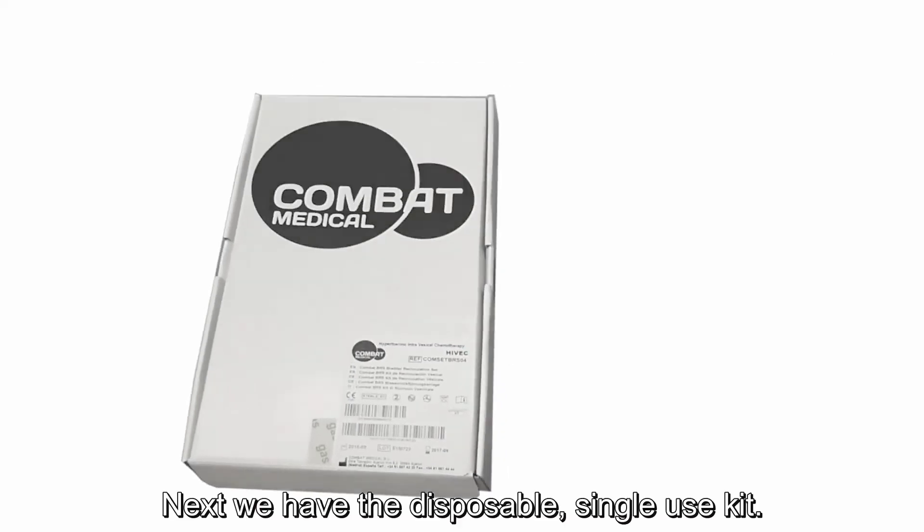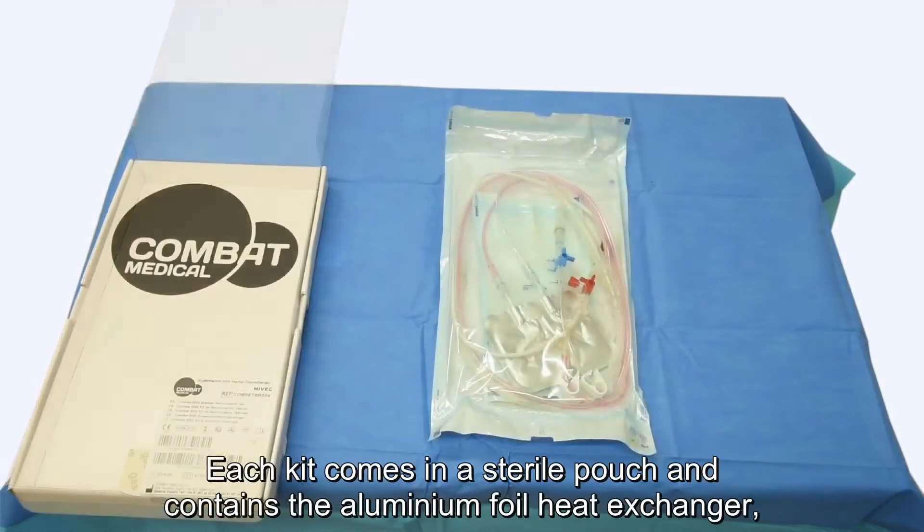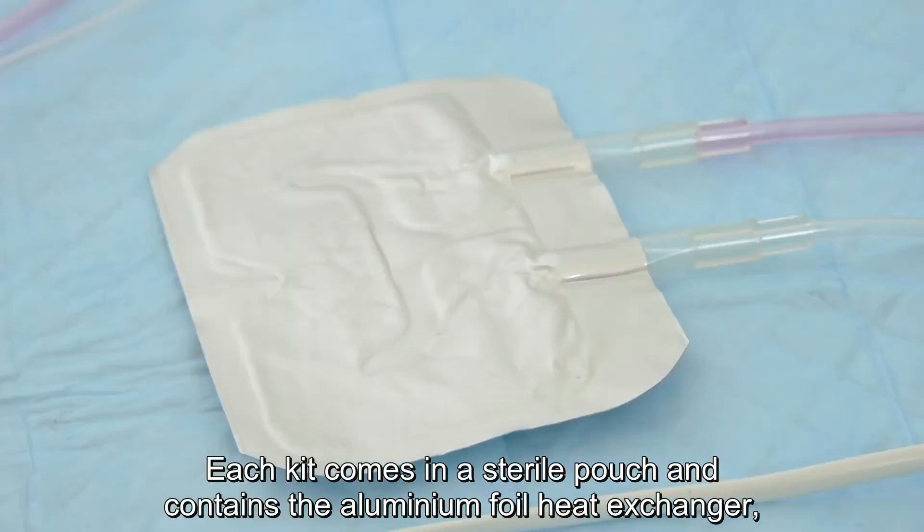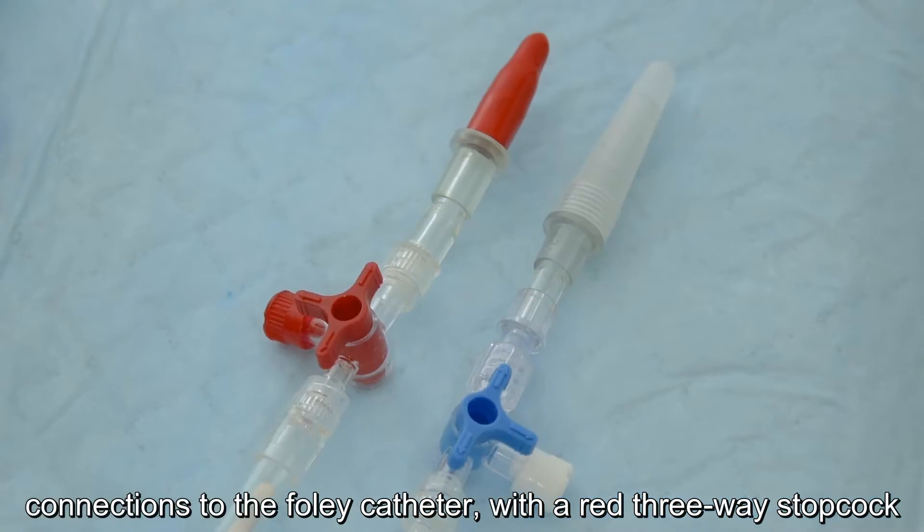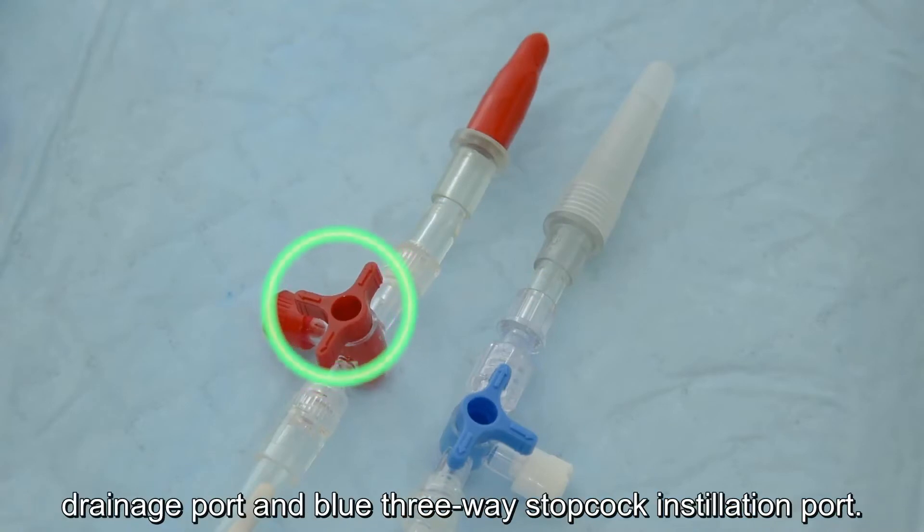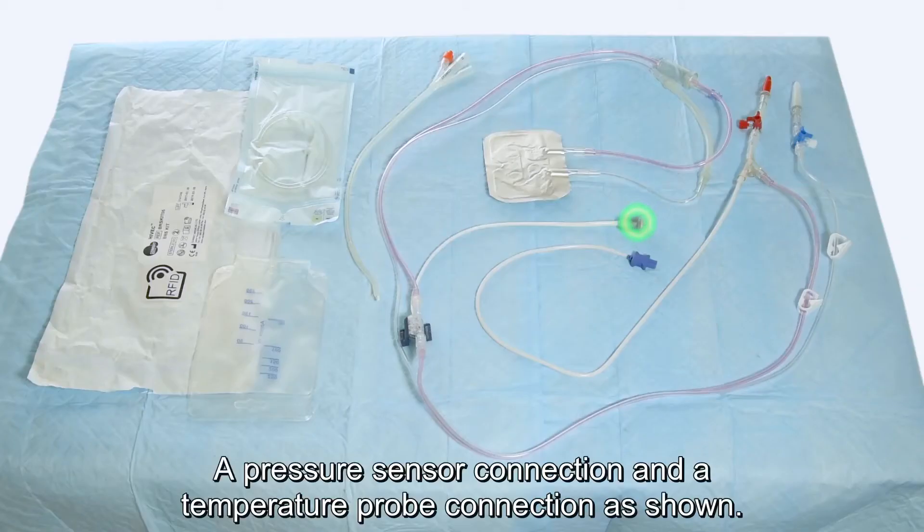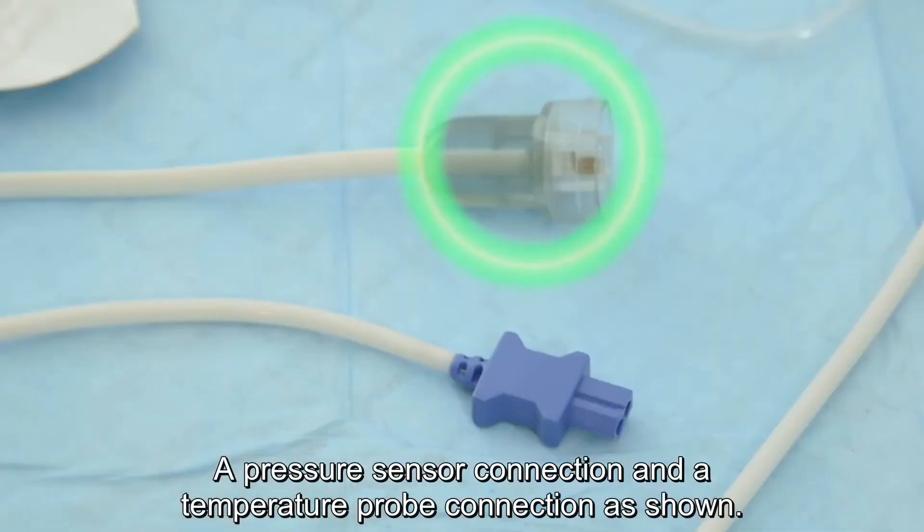Next we have the disposable single-use kit. Each kit comes in a sterile pouch and contains the aluminium foil heat exchanger, connections to the Foley catheter with a red three-way stopcock drainage port and a blue three-way stopcock instillation port, a pressure sensor connection and a temperature probe connection.